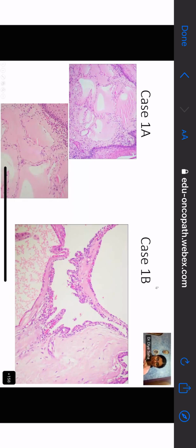Okay. But I think that there is some prevailing view because it was reflected in two things. One that you said and one that Suveta said. And what did Suveta say? That it is continuous and it is flattened, which suggests, Suveta, that if something is continuous, it must be an epithelium. Is that what you believed, Suveta? No, ma'am. Epithelium can also be discontinuous. Oh, an epithelium can also be discontinuous.